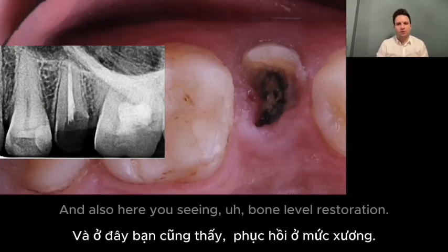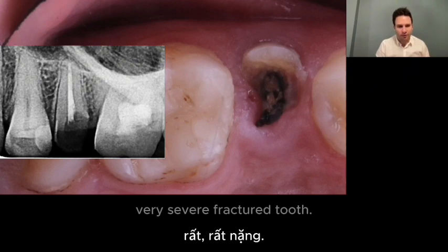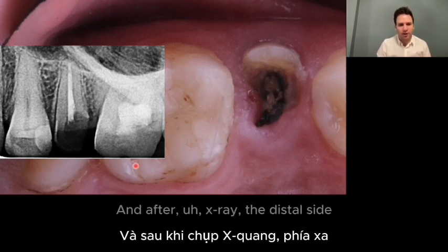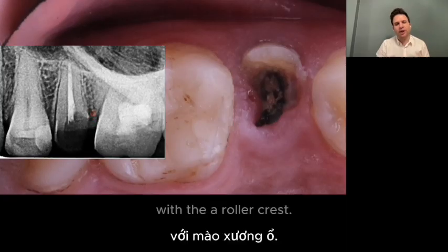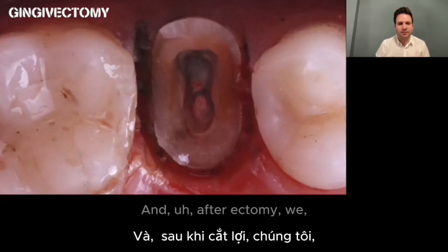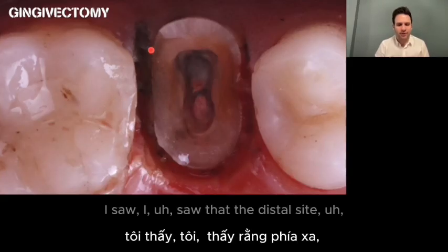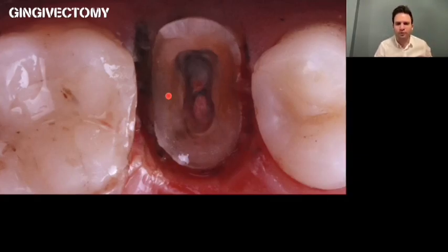And also here you are seeing bone level restoration, and the patient has a very severely fractured tooth. After X-ray, the distal side of the tooth was almost at the same level as the alveolar crest, and after gingivectomy I saw that the distal side is almost at the same level as the distal bone.